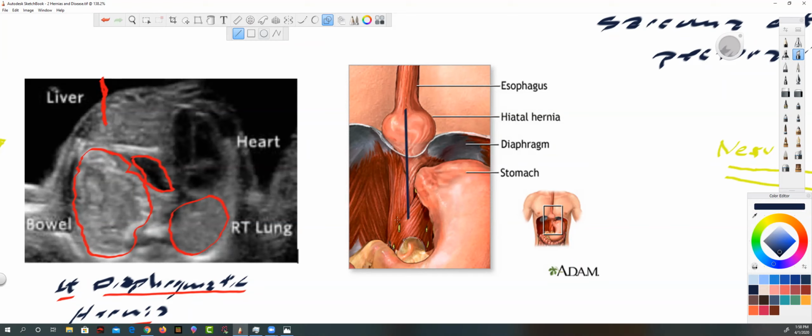Okay, so our first image is, I think most people start sagittal at the epigastrium. And this is right at the epigastrium. You can see this is the right hemidiaphragm, hemi being two, left hemidiaphragm over here. And of course, this is all diaphragm underneath, but that's just the cut edge of the diaphragm here.